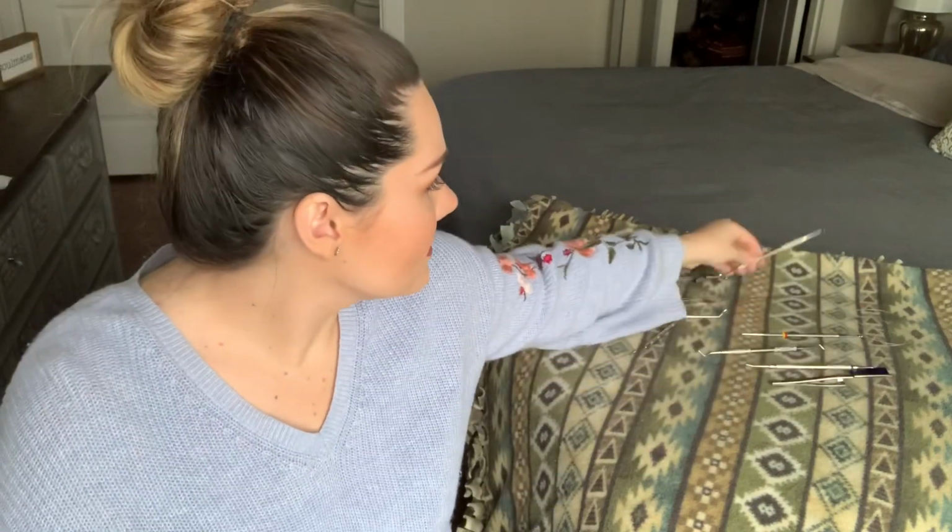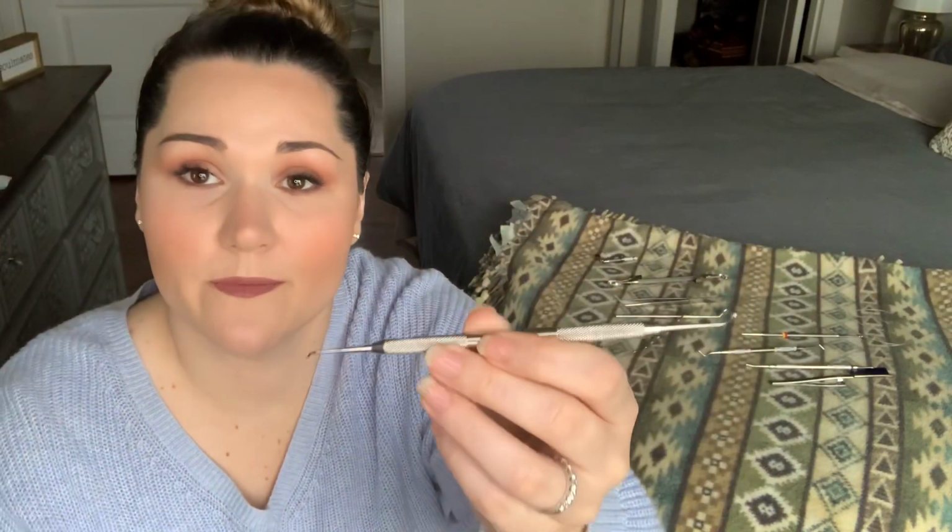Well, then I give him the ball burnisher because it kind of burnishes the filling. It polishes a little bit and then it just smooths it out. So he'll smooth the filling with the ball burnisher. And then that's it. That's the amalgam filling. Again, pretty easy. And again, all dentists are gonna be different.